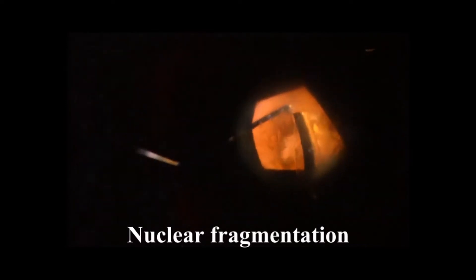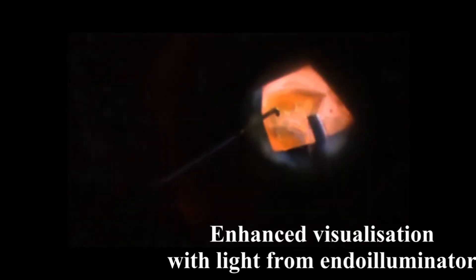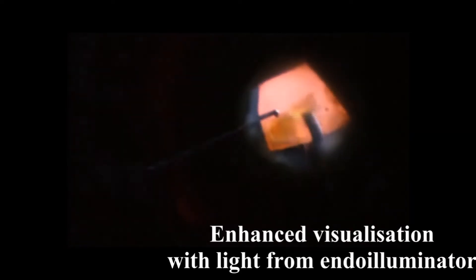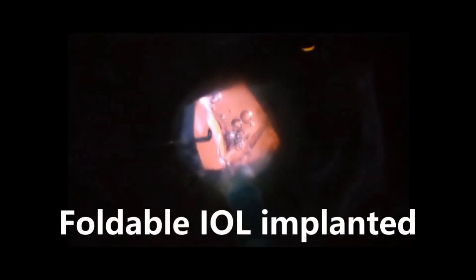The nucleus was fragmented and emulsified with the aid of chandelier retroillumination. Cortical aspiration was completed and intraocular lens implanted solely under chandelier illumination. The six-week post-operative visual acuity was 6/18 and N24.